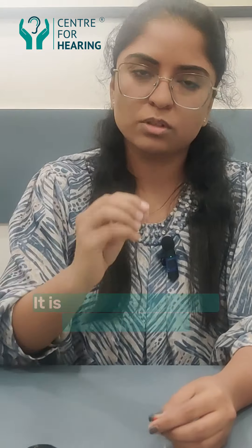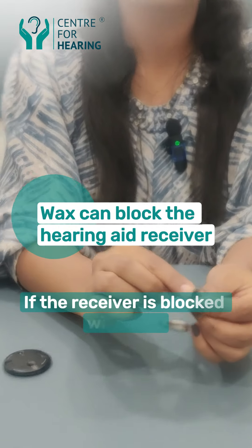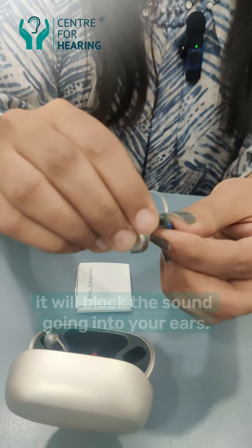In all of us, there will be some wax. In some people, it becomes a lot of wax. That's why your hearing aid receiver can get blocked. There are filters here, and wax can also become impacted here.